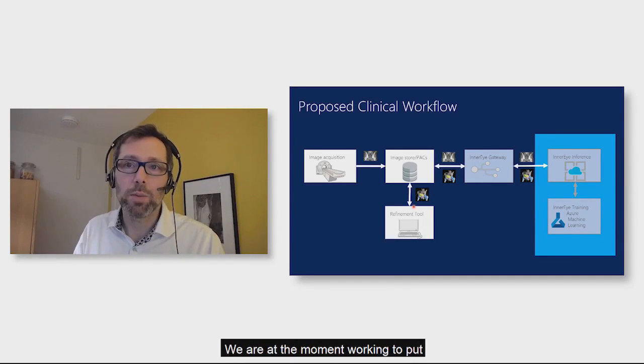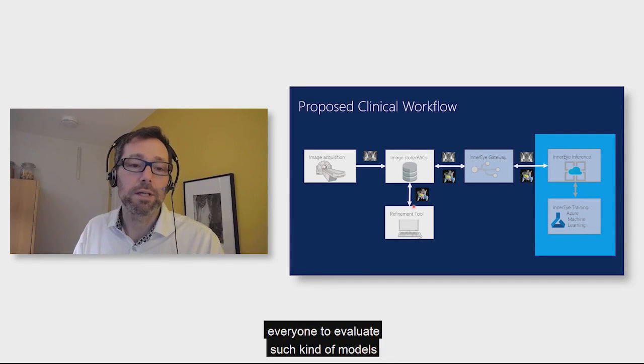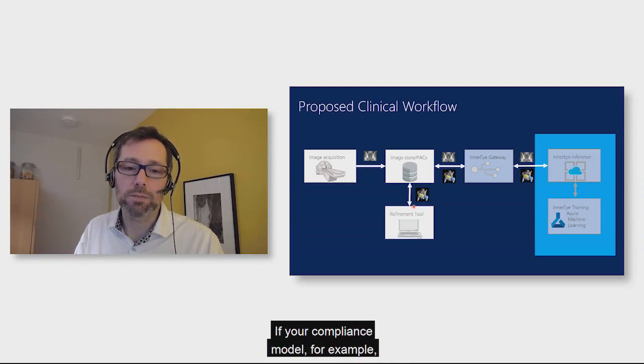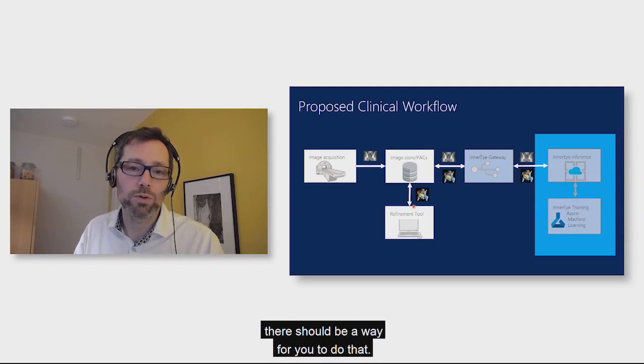We are at the moment working to put those additional pieces in place to make it easier for everyone to evaluate such kinds of models in a typical hospital setup like I'm showing here. And this should work both in the cloud, but also on-premise. So if your compliance model, for example, requires that data does not leave the hospital trust boundaries, there should be a way for you to do that.